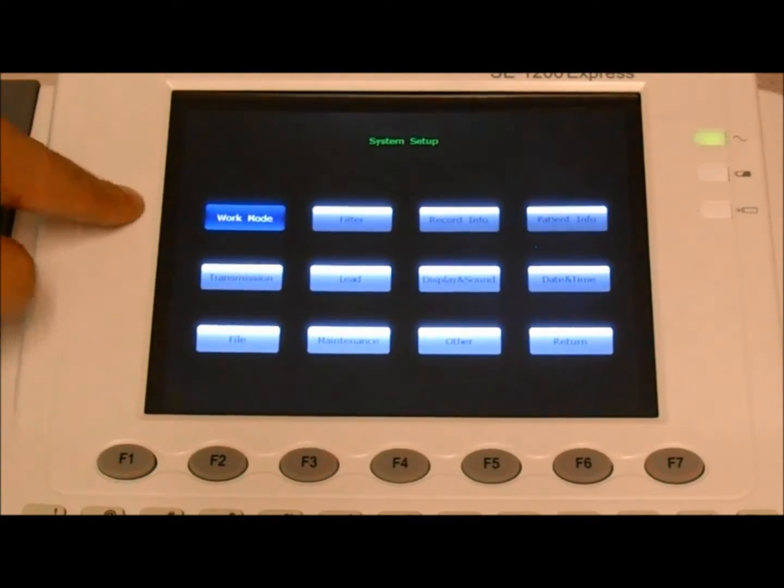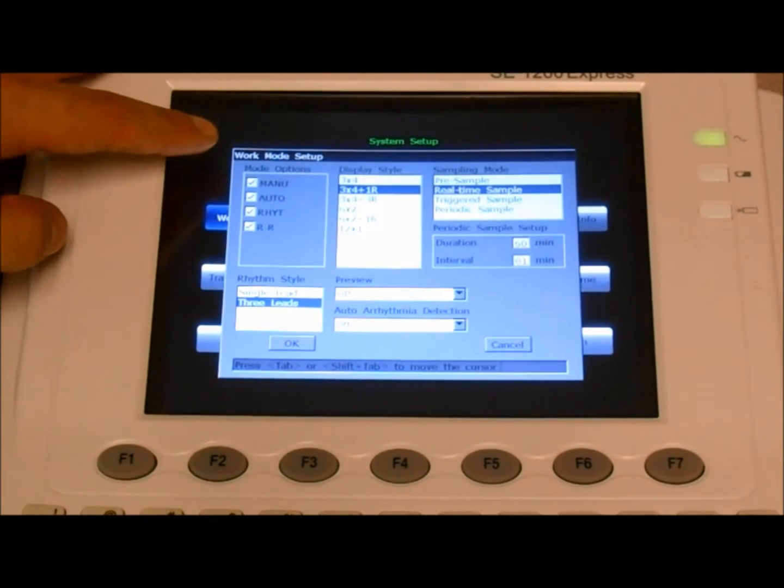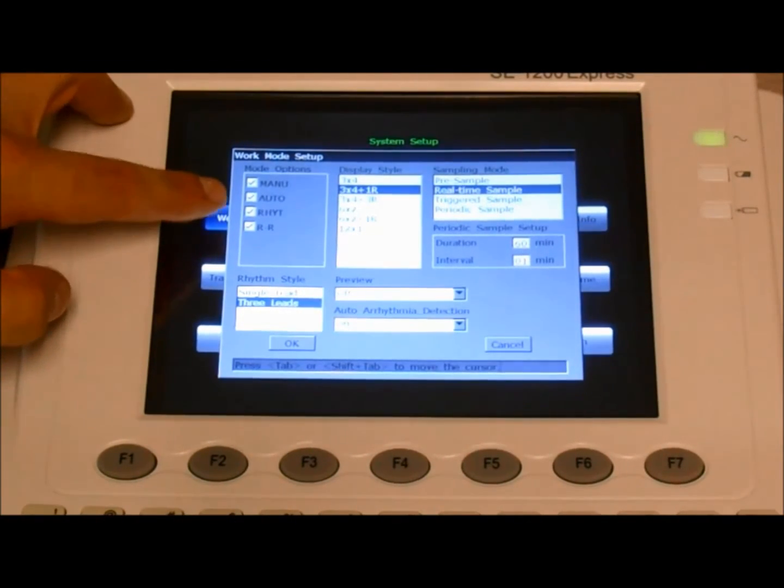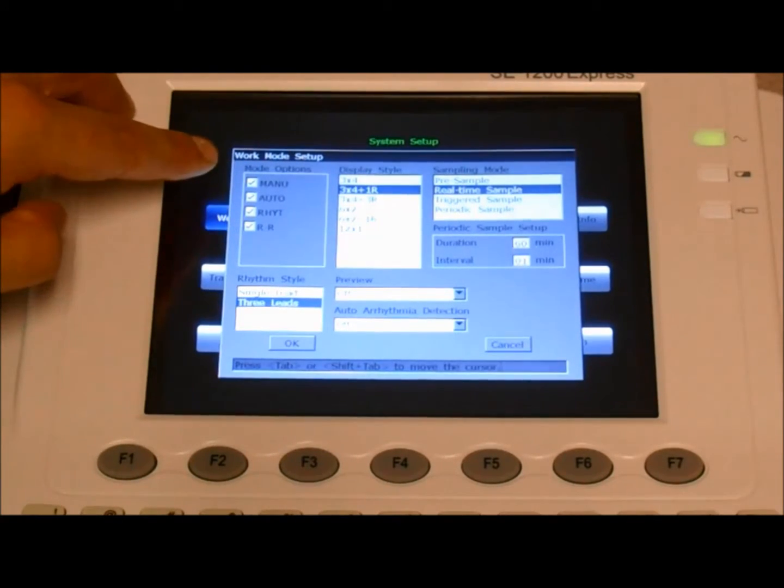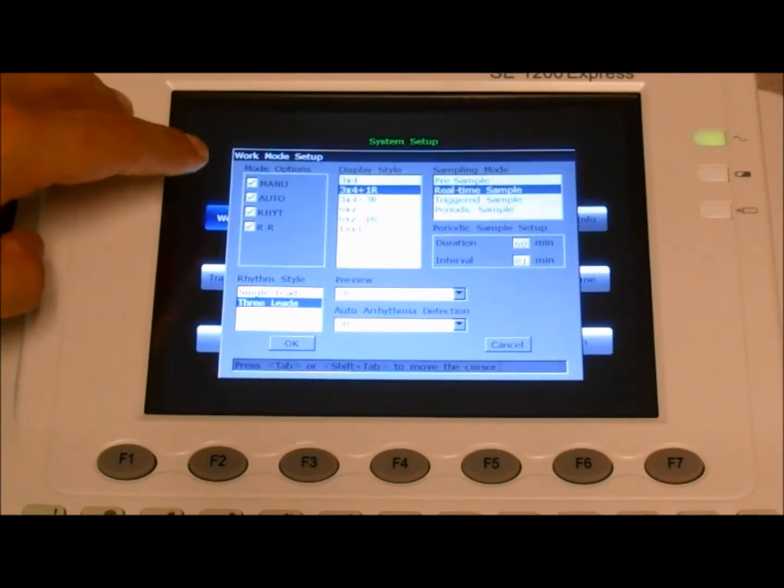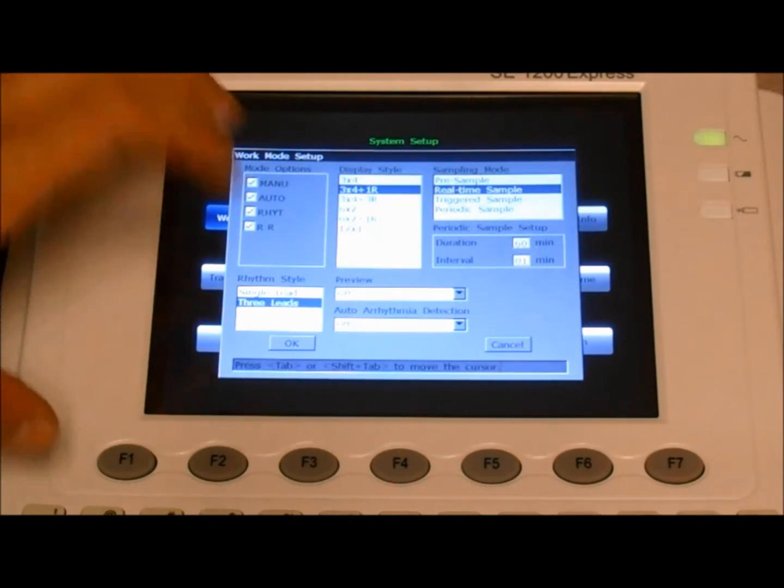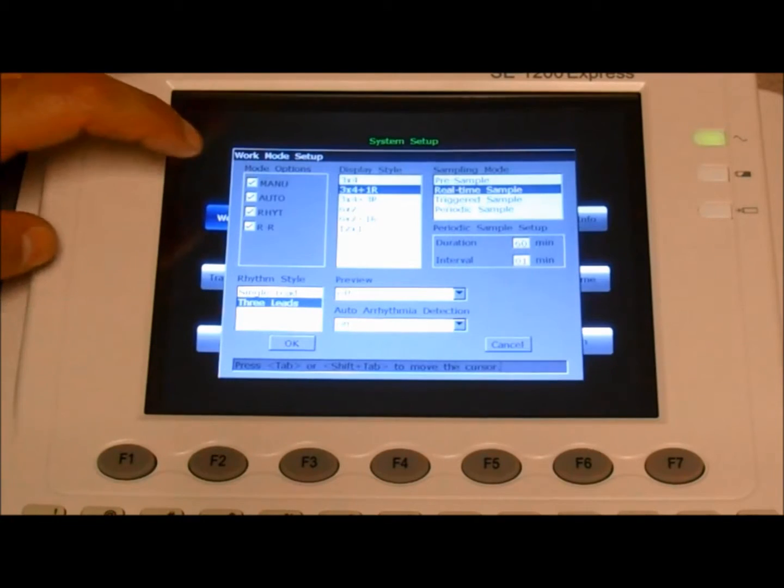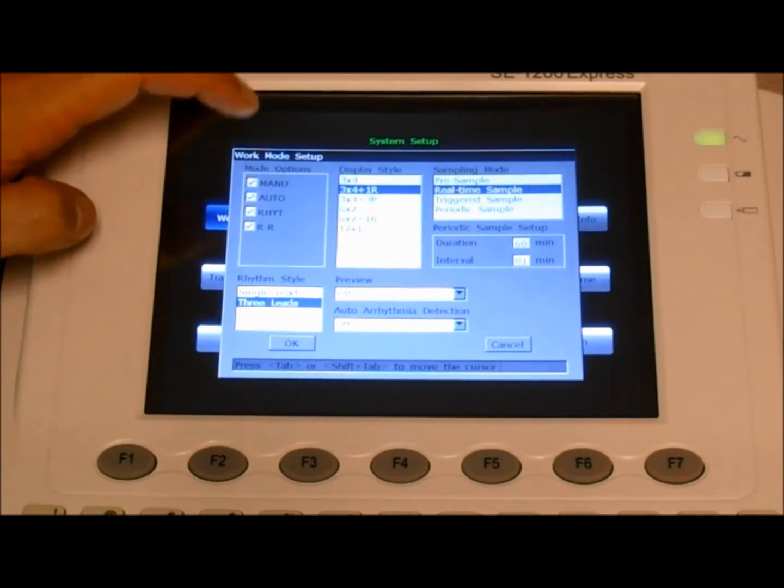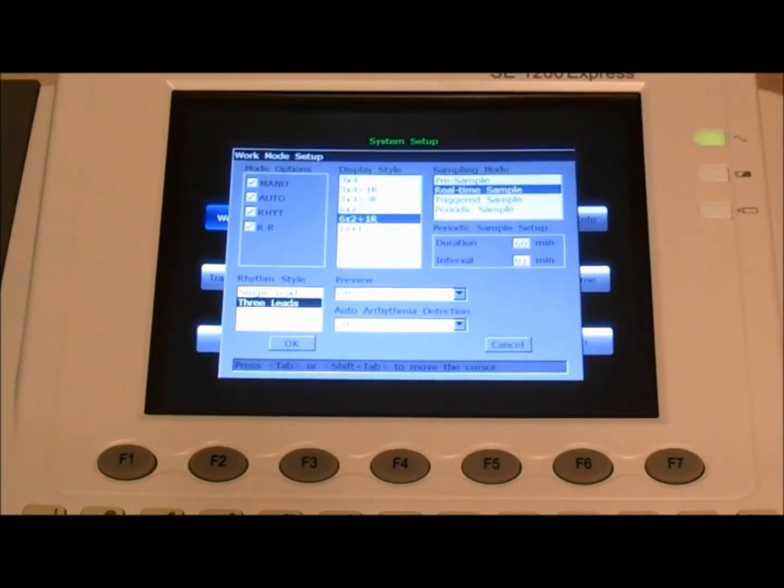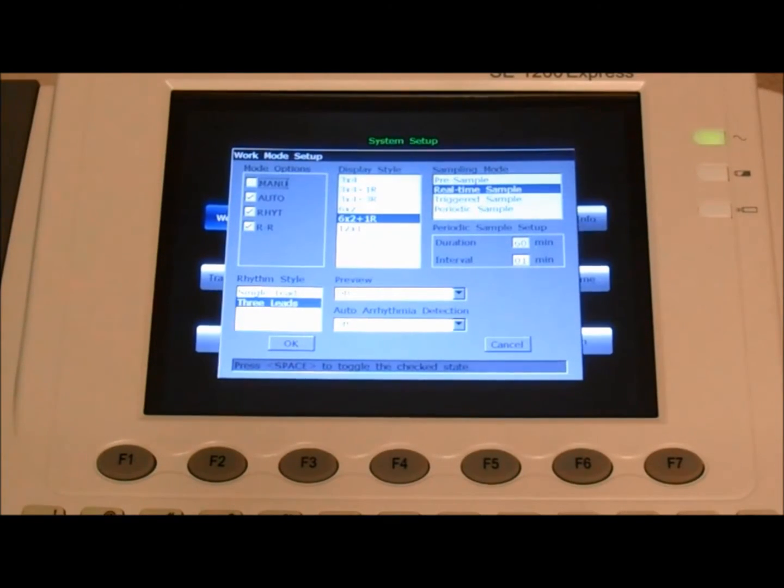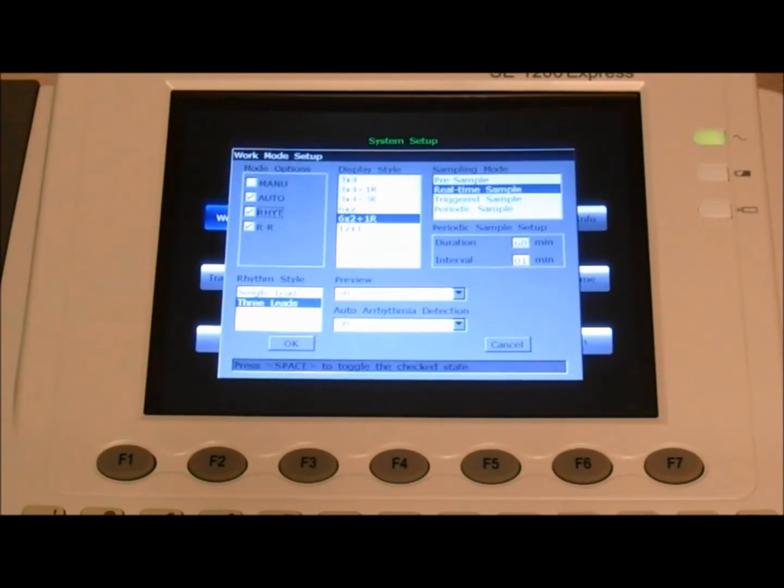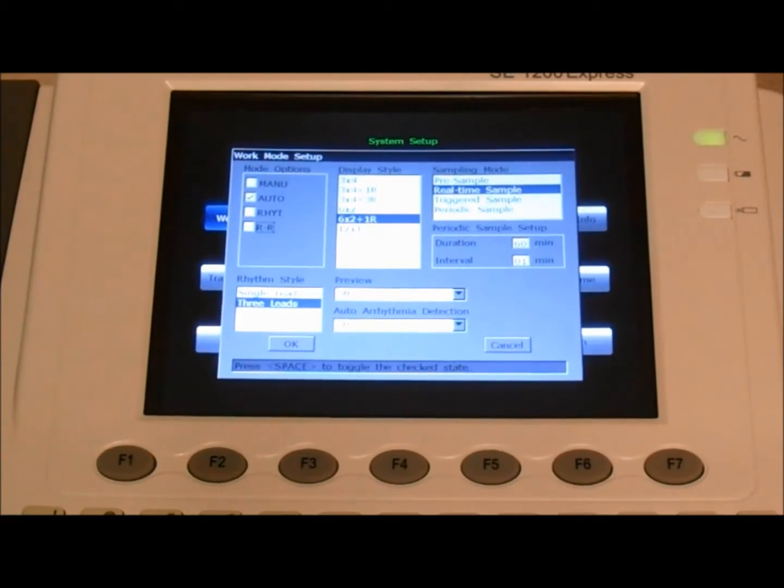Select the work mode and under mode options, you want to ensure that only the auto option is selected. All the other settings or options need to be unselected. If you have an SE1200 Express unit, your interface is touch screen so you can tap on the option and deselect it, otherwise use the tab to navigate and once the option is boxed, press on the space bar to change the settings. So manual is deselected, keep auto selected, rhythm unselected, and RR unselected.